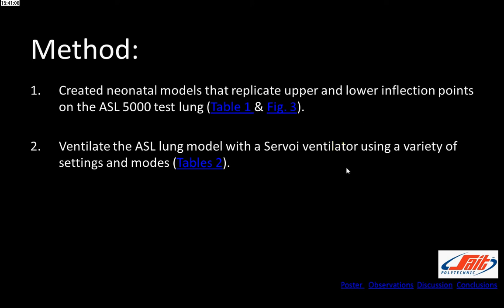Then I ventilated this using the Servo-I ventilator, and I used a wide variety of settings just to see how easy it was and what the most accurate way to view those inflection points is.